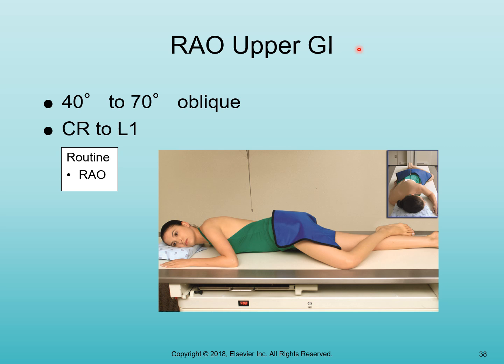Our technique is the same as it's been: 110 at 2 for a single contrast study, 90 at 2 for double or water soluble. The patient lies on their stomach with their right arm down behind them. Their left arm is up in front.